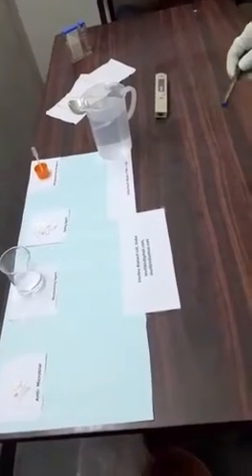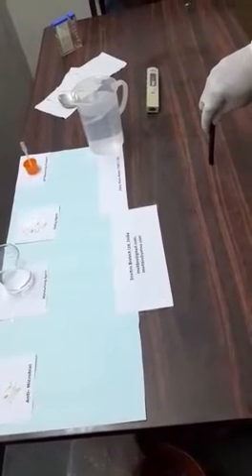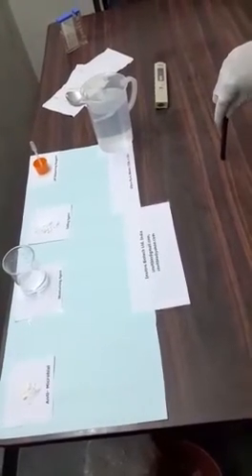Today we will make ultrasound gel in our lab. Ultrasound gel, as you are aware, is used by a radiologist for conducting ultrasonograms. Ultrasound gel is also used by a physiotherapist for physiotherapy sessions.